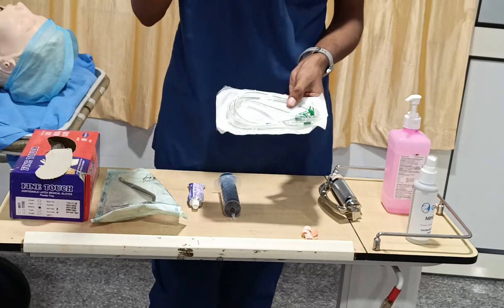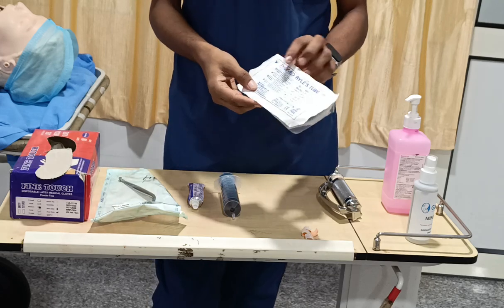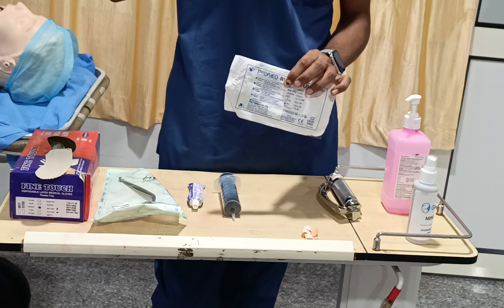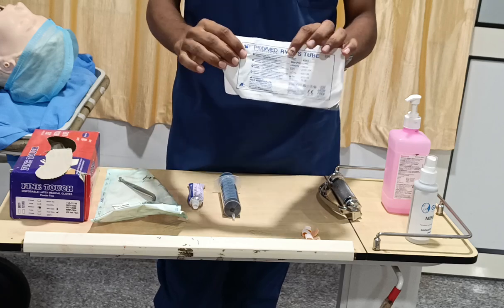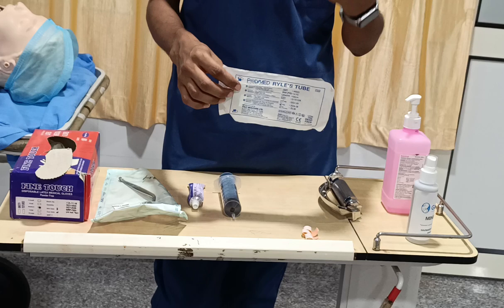In that, the white center portion is a 12 French. So white is a 12 French, and then your green is a 14 French, and then your orange is a 16 French. By remembering your national flag, you can remember that 12 is white, 14 is green, 16 is orange. Mainly these three sizes only we will use in adult cases.